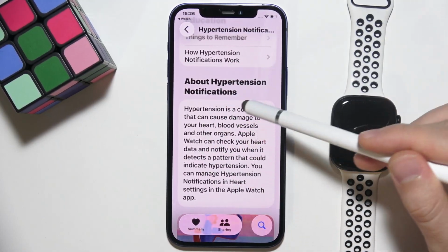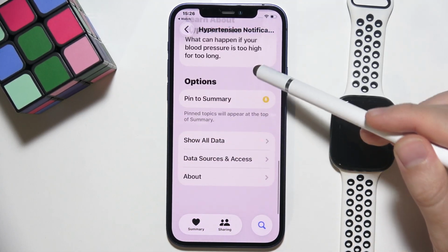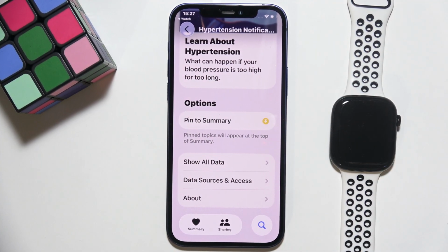There's also short information again about notifications for hypertension and some other things that you can learn about this. And here you can find the number of measurements, if it was actually recorded.